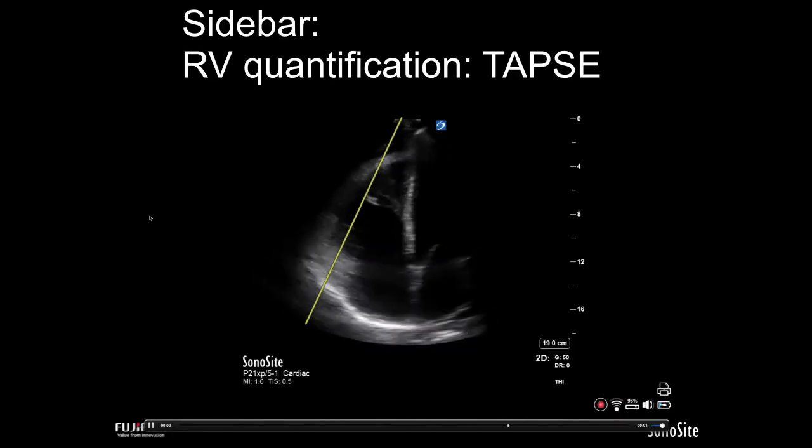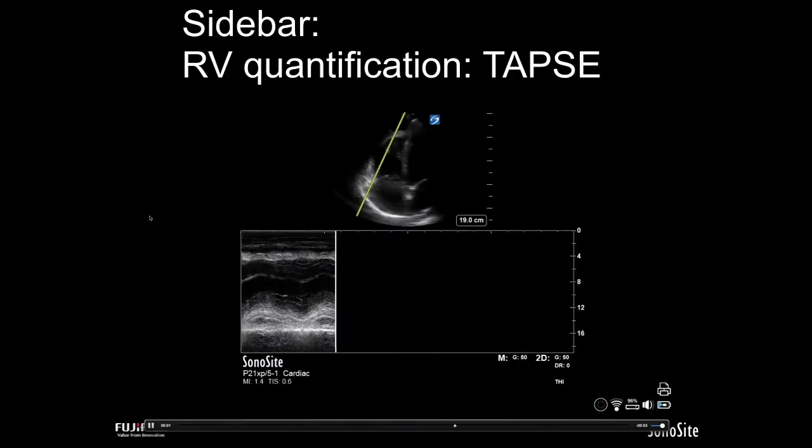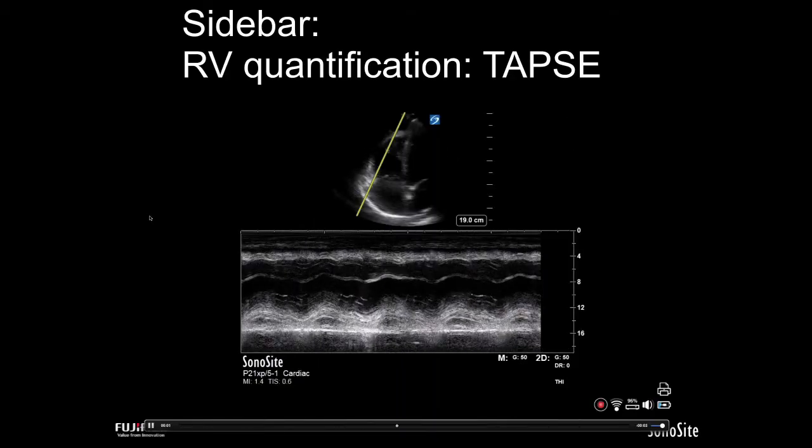And when you feel you've got a good hunk of tissue there to go through, you just enable the M mode. And it's going to give you the farthest point down here where you can see the vertical slide of the tricuspid valve annulus. Now, it's important to note that because time is the x-axis, the absolute vertical distance that the tricuspid annulus travels can be measured either in a straight up or down approach or a diagonal approach. The machine discounts any vertical or any horizontal contribution and just does the absolute vertical distance between any 2 points.